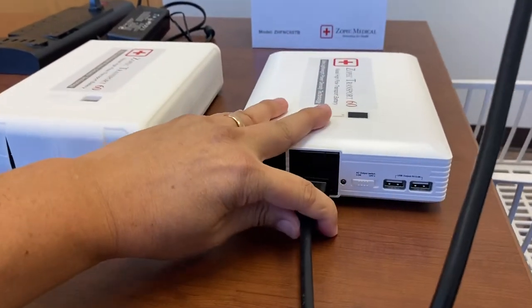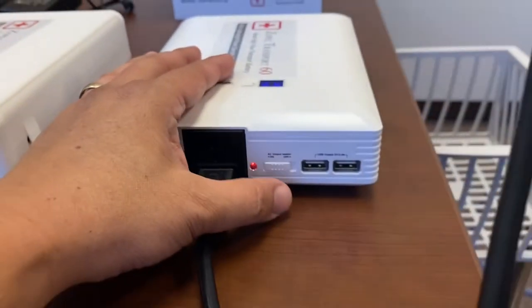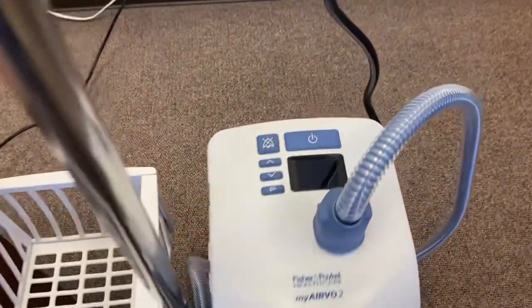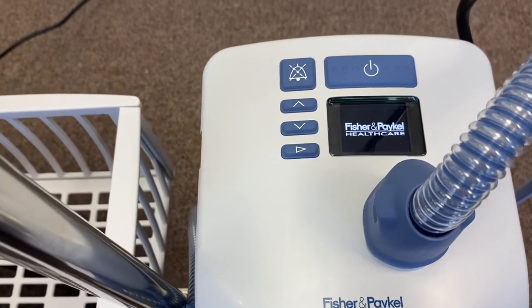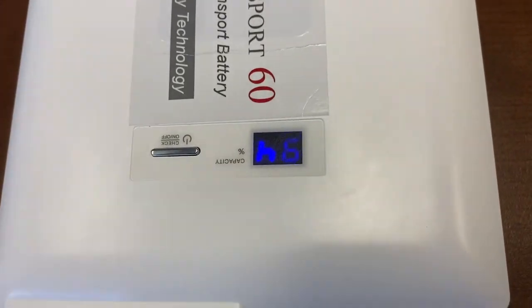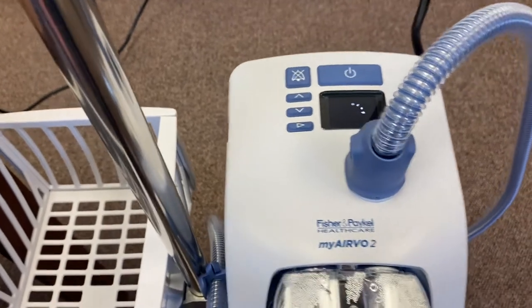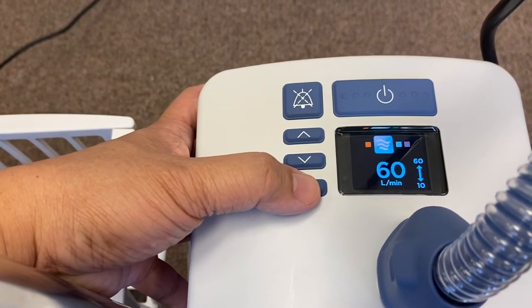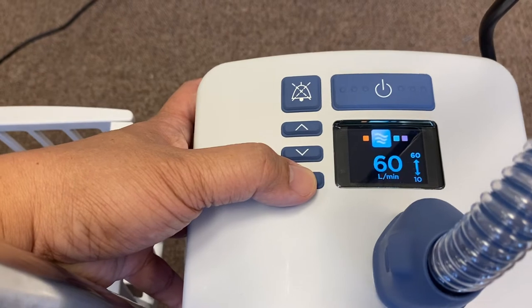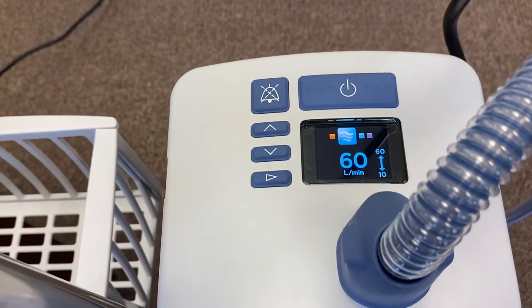You just plug it in just like that, then start the battery, and the red LED light is on. You can see that it turns on right away, and it's drawing a lot of power and already starting to deplete the battery. The setting is 37 degrees Celsius and 60 liters per minute — the maximum setting — and the battery started the AirVo2 with no problem at all.